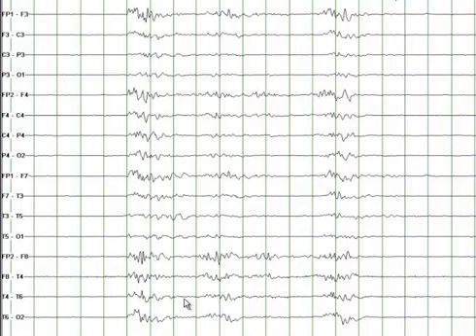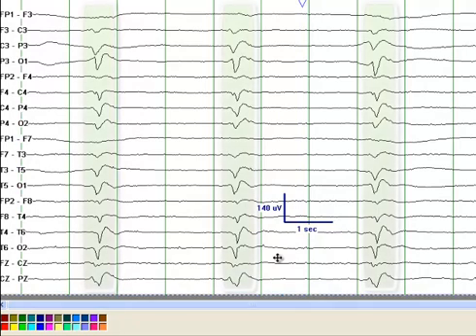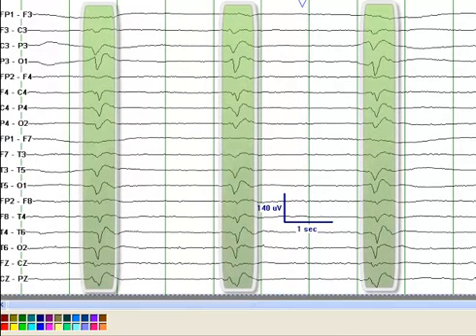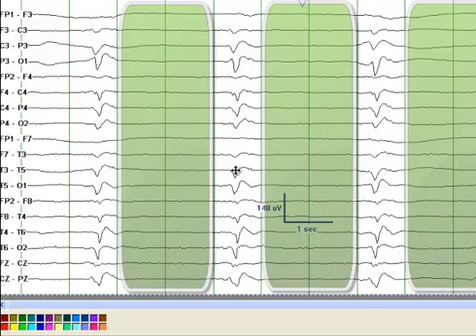As you taper off the medication or the anesthetic agent, the periods of burst will increase and the periods of suppression will reduce. Here you see an example of a burst suppression pattern that has evolved into generalized periodic epileptiform discharges. In patients who have suffered a severe anoxic brain injury, as the depth of coma worsens, the periods of suppression get more and more prolonged and the bursts become shorter in duration.